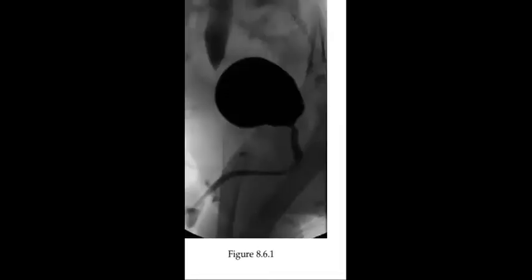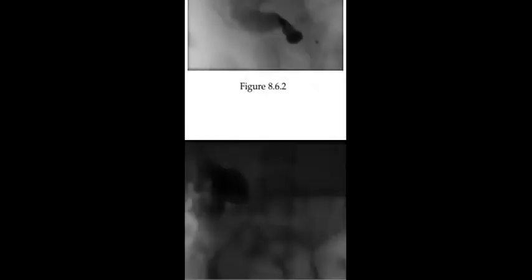And if you go to the bladder again, in this view, you check for the posterior urethral valve. There is no posterior urethral valve. So there is reflux in the lower moiety of the duplex right kidney. There is ureterocele of the distal ureter, but without reflux. So yes, an associated ureterocele.